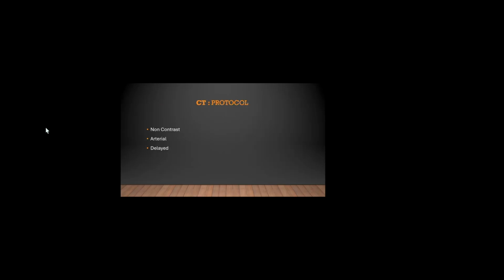Considering it's not in every trust that they have the capability or the expertise to do ECG gated studies, maybe sometimes in tertiary centers we often receive a request to repeat a scan that was performed just the night before, because it was performed in another trust as a non-gated CT scan. So that is also a point to consider: maybe ask the radiology team, do you perform ECG gated studies or not, before exposing the patient?